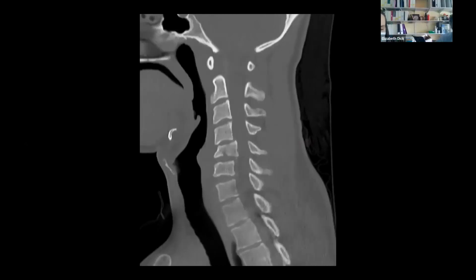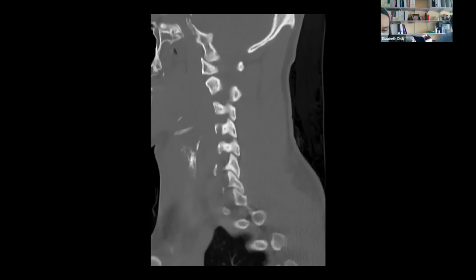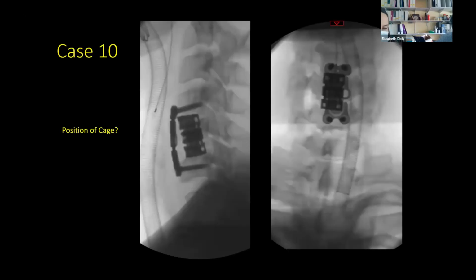So this is a patient with an unstable fracture of C5, and this patient had a cage fixation. We wanted to show this really to talk about the principles behind cage fixation. Not everything is fixed from the back in trauma. In fact, quite a lot of the time, an anterior fixation is the more elegant and a less morbid operation to do. This was a young man who had a rugby injury on a weekend. He was otherwise fit and well.